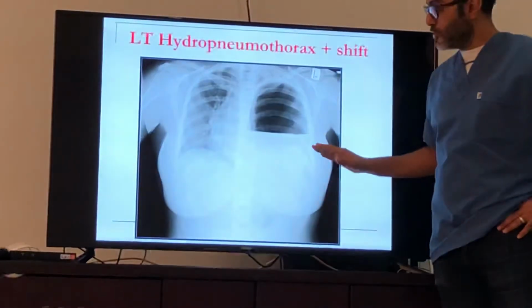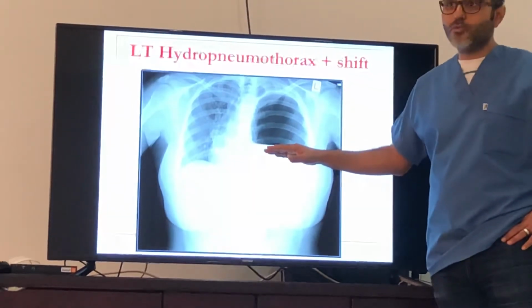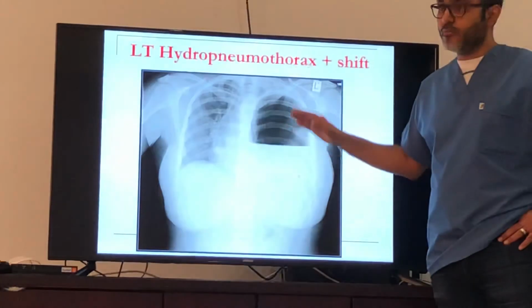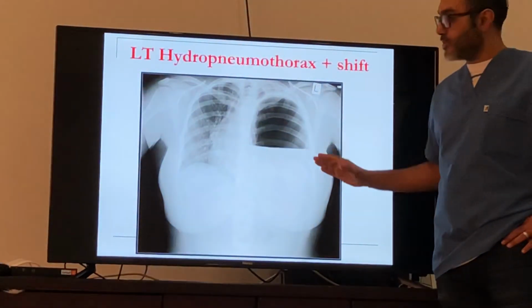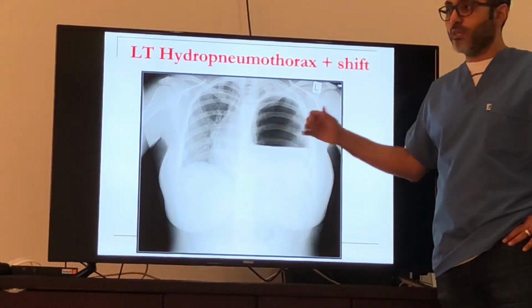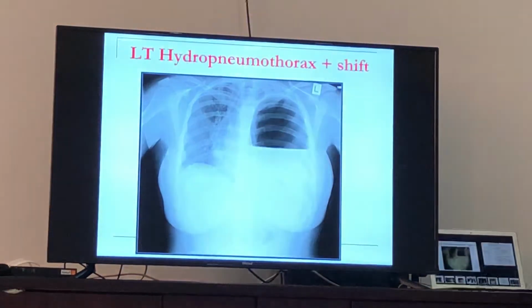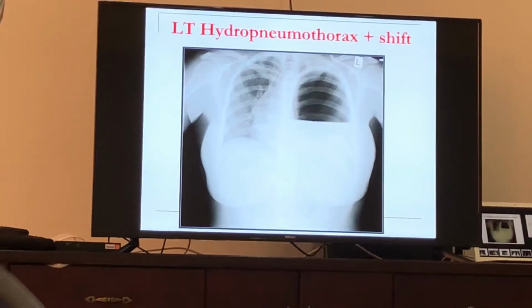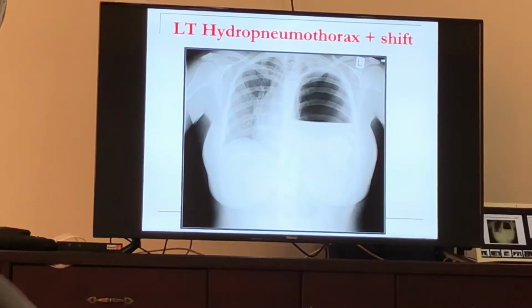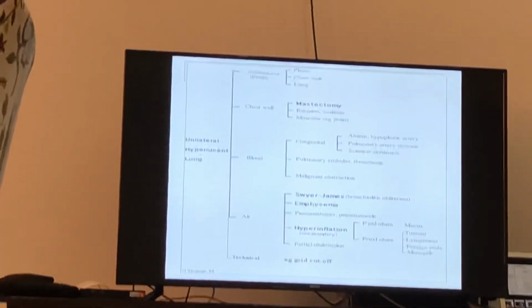Usually we try to go midway, to be able to drain the fluid and at the same time drain the air. Air will come out. Or if it's not, then you should go up. Then sometimes you put it under suction to be able to bring out all the fluid. But definitely you'd be more biased to the air than the fluid.